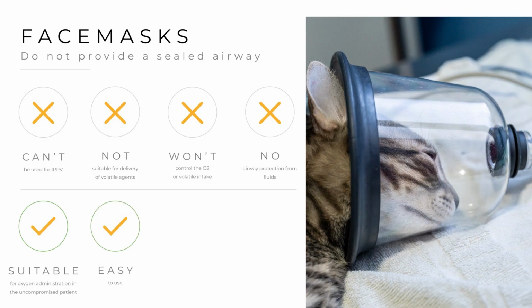Face mask. These devices are manufactured by several different companies, but they all look roughly the same as the ones shown in the picture. The face masks are simply placed over the patient's mouth and nose, and they breathe in the natural way. Face masks do not provide a sealed airway. They do not have a fluid seal, nor do they have a gas seal.